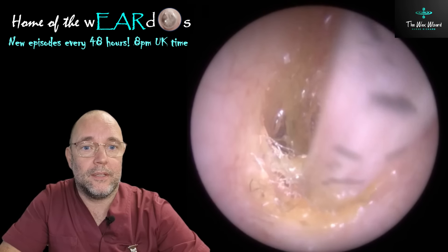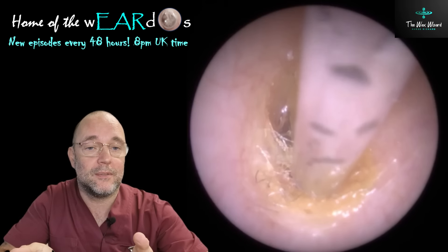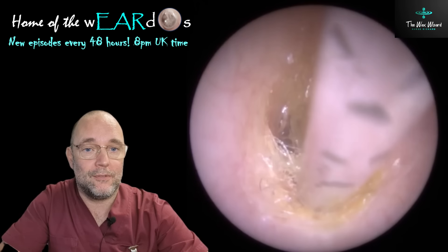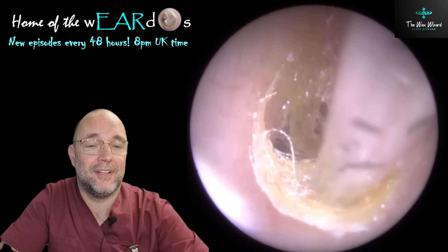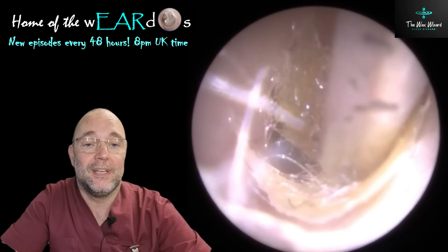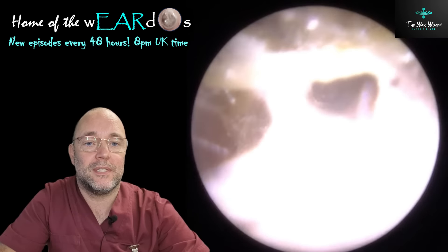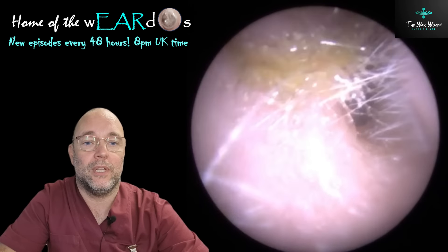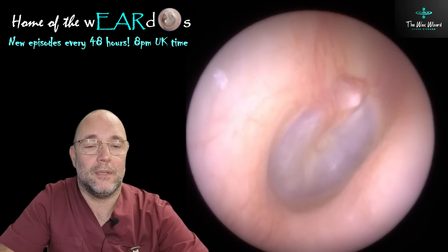And the first two years are from the same patient, who you can see has been wedging a cotton bud in her ear. I've kind of lost the will to live sometimes. I've stopped asking have you brought a cotton bud in, because you can always tell. It was quite a difficult bit to get out, so I put a load of olive oil in there just to drown it, and thankfully it helped me get a reasonable grip and pull that out quite nicely.